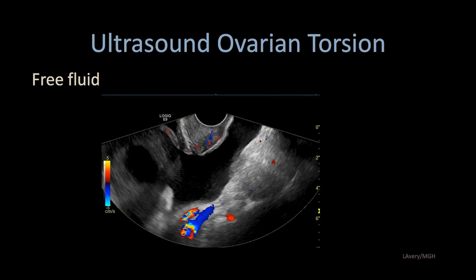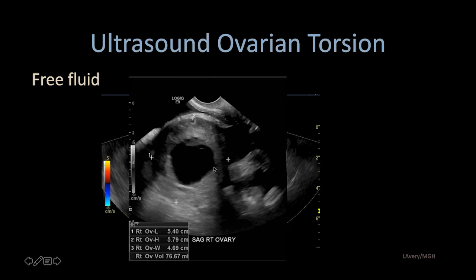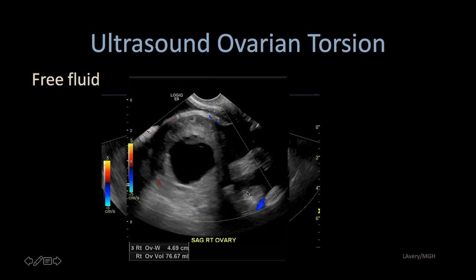Free fluid can often be found in the setting of torsed ovaries, and this should be simple serous fluid. This ovary is enlarged up to 5 centimeters in diameter in all planes without any Doppler flow, and this was a torsion ovary with a significant amount of free serous fluid in the cul-de-sac.